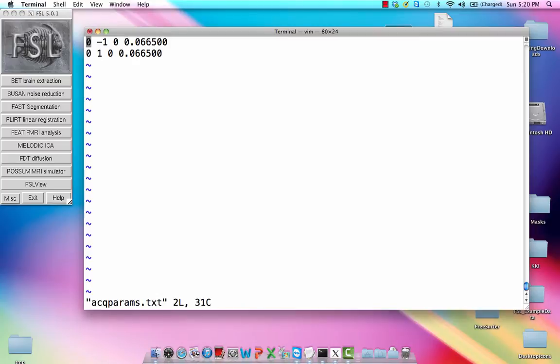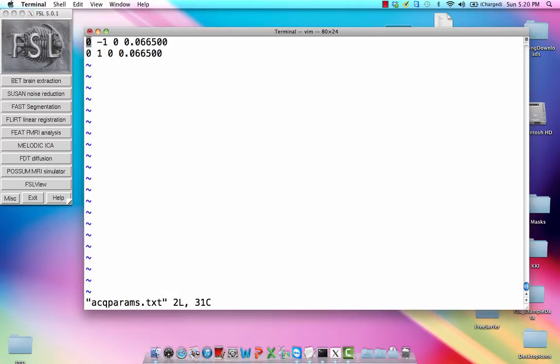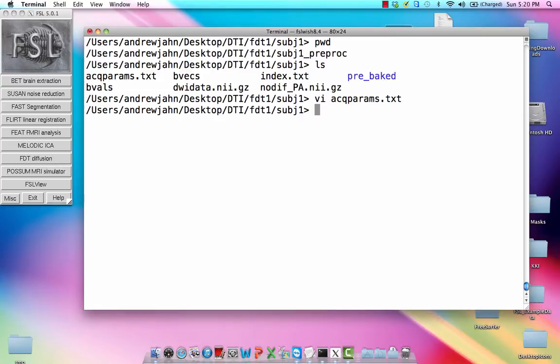So just briefly to just look at ACK params, this gives you a couple of rows and this number right here in the second column that tells you whether this was acquired in the anterior to posterior direction, the posterior to anterior. And this last column is the readout time from the first echo to the last echo. It's just something you'll need from your scanner technician about when this scan was acquired to get a sense of how to unwarp these distortions when you apply top-up.